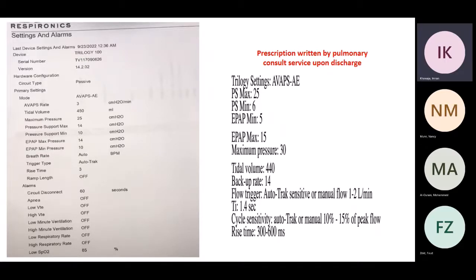The reason for this patient is bad deformity, and I think it will require more pressure to expand. But if I'm dealing with someone with a lot of emphysema, I may even make the maximum pressure 25 or maybe not more than 30. But in her case, this is me having an error in typing. I wanted the maximum pressure 35. So this is a safety mechanism in the machine. It will not let your pressure support and IPAP go beyond this.